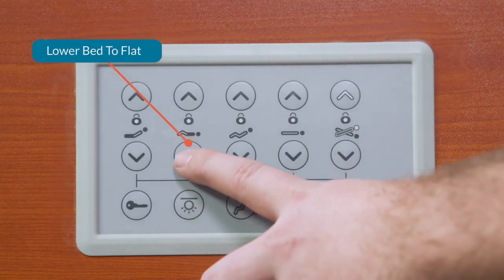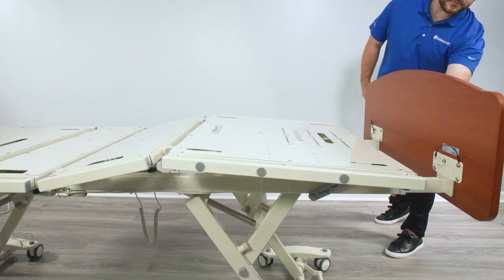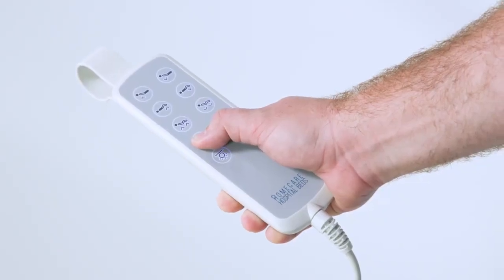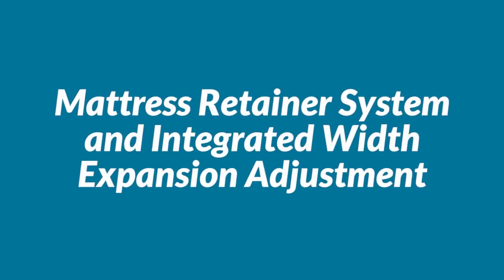Using the staff control panel, lower the foot of the bed to a flat position. Lower the bed to ensure the moving parts will not pinch or shear the cable. Raise the bed back to the highest position. Mattress retainer system and integrated width expansion adjustment.